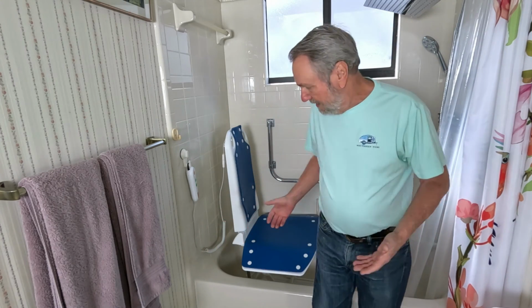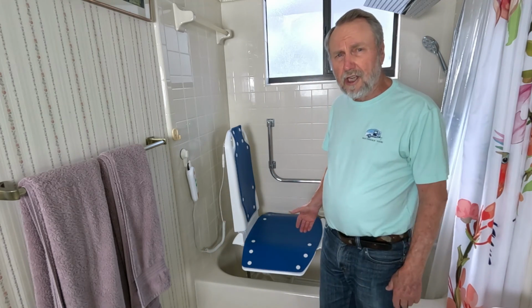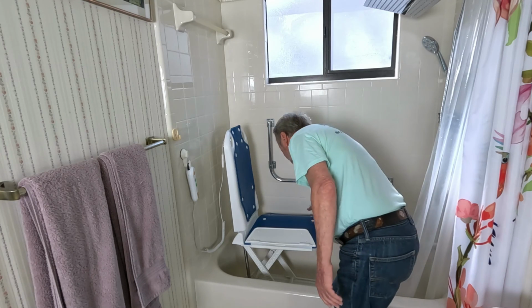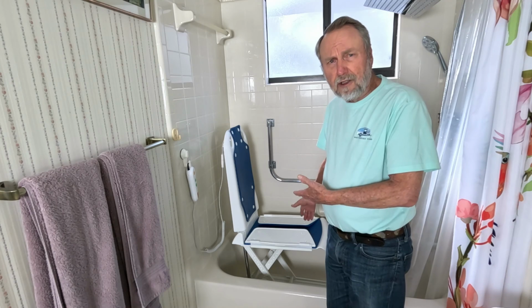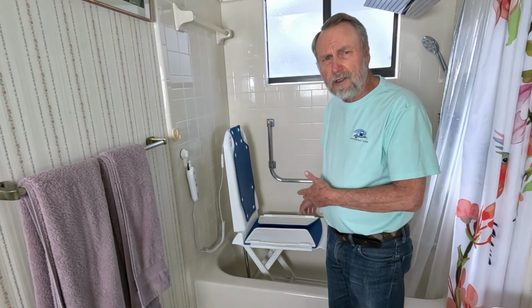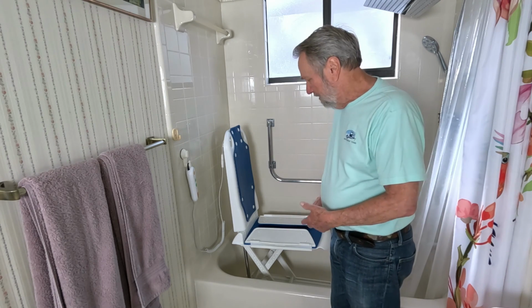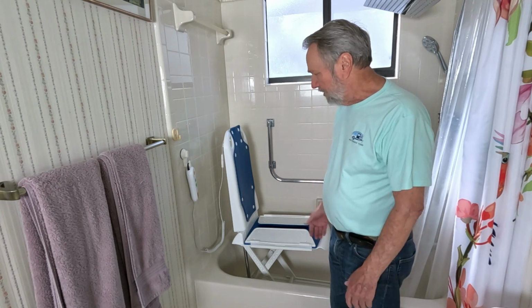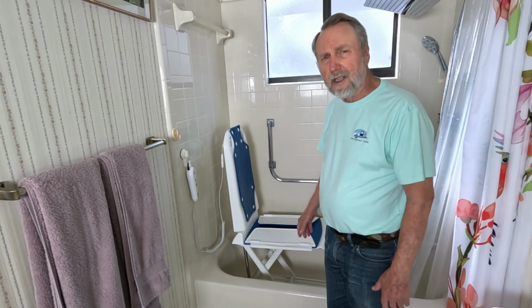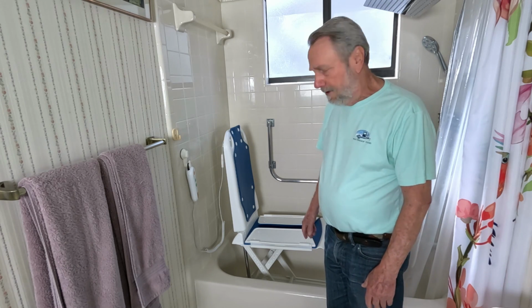That's the way you can use this chair. You could just close this up, and it can just stay in that position for the next time you're going to use the tub. And so you don't really have to take it out of there under these conditions, and it's ready for your use as much as you want.